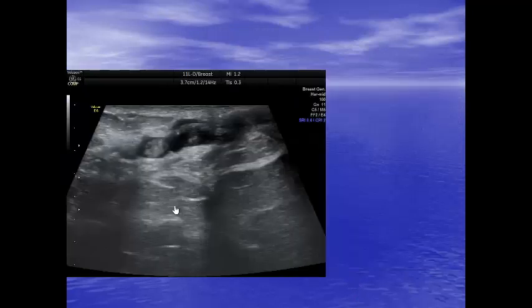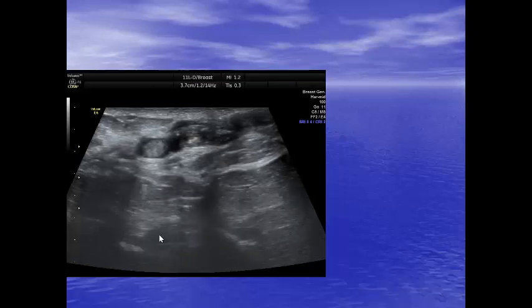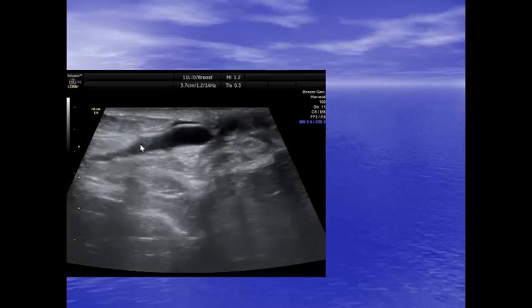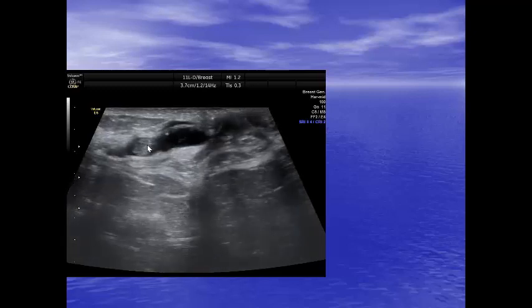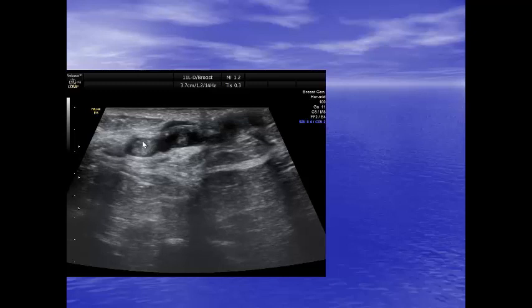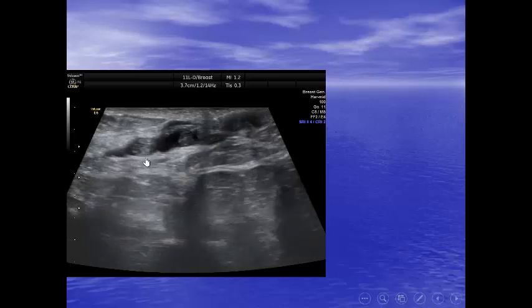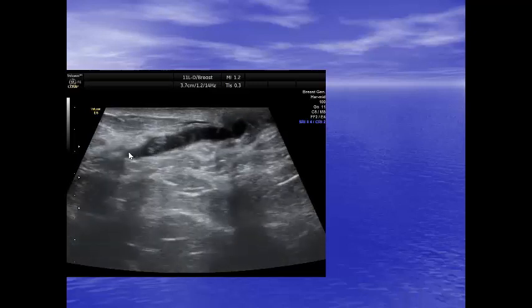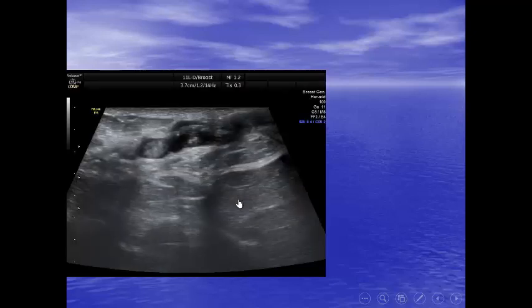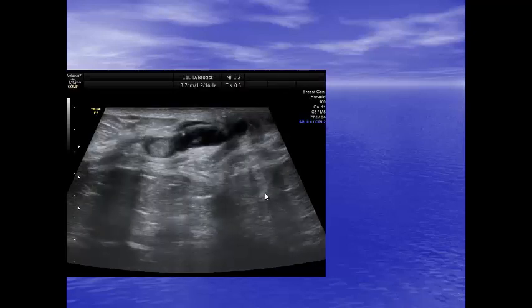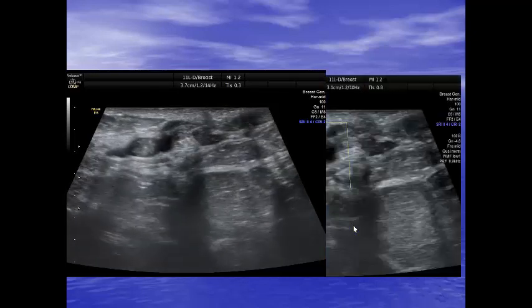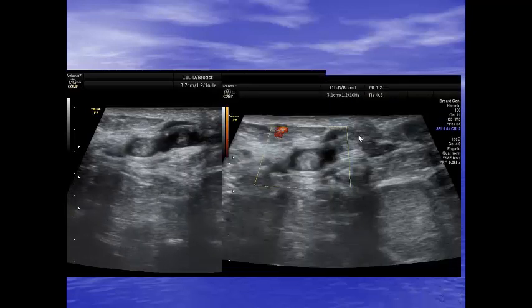This is another case. Here we have dilated ducts, and these dilated ducts show a ball-like lesion that is not attached to the wall. This is the dilated duct, and at first we could think this is echogenic secretion. But you have to trace the duct all the way through — on tracing, there is another lesion here.